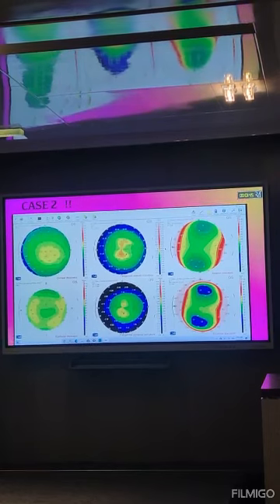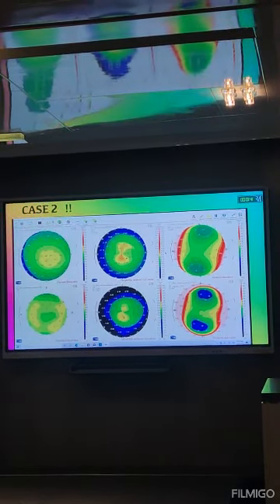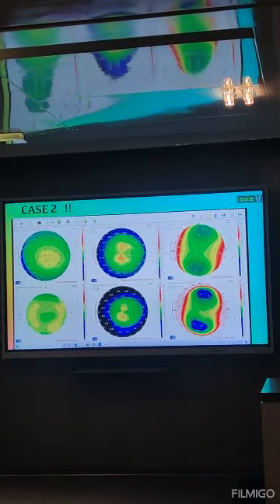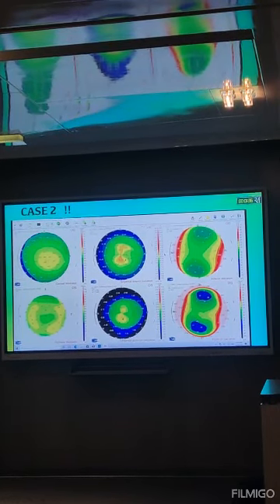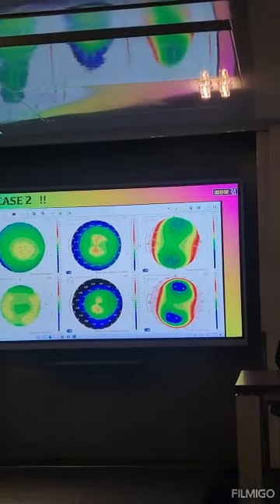There is a difference between mechanical ectasia and keratoconus. I have seen cases like this, especially with eye rubbing, because the tongue-like extension usually comes from the temporal side, where the patient rubs his eye. The configuration shows some sort of skewing also. And the configuration is not classic for keratoconus or genetically induced keratoconus.